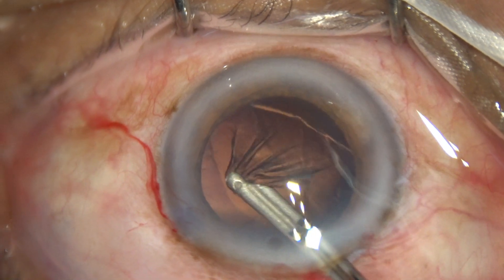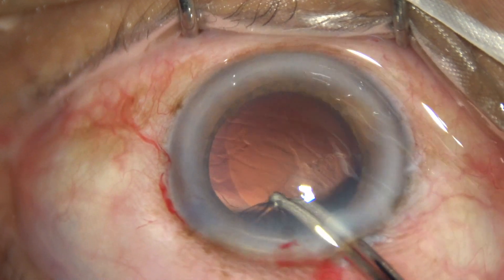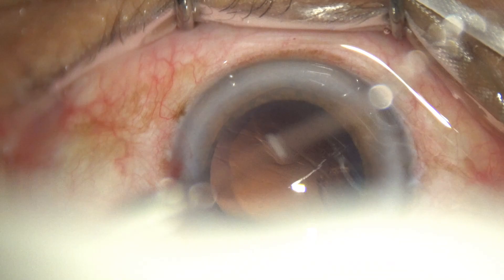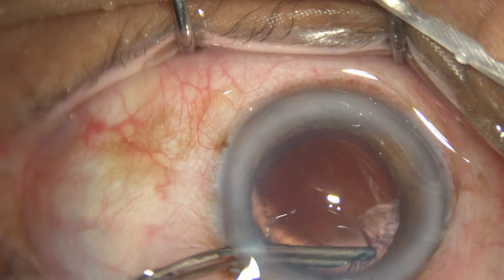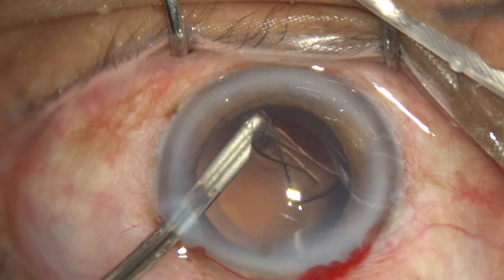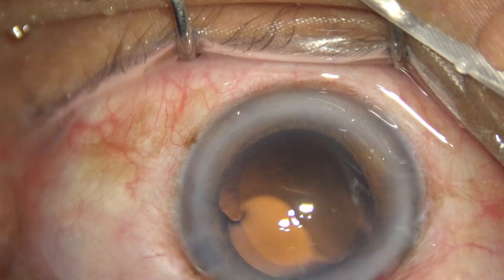A 23-gauge Simcoe cannula is used to gently remove the cortex. The cortex was firmly adherent to the posterior capsule; however, since the nucleus was rotated several times, the cortical cleanup has become easier.